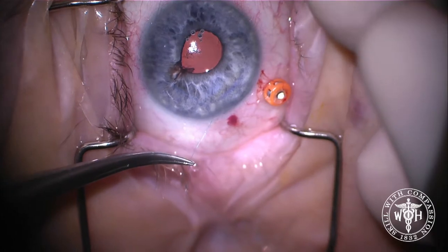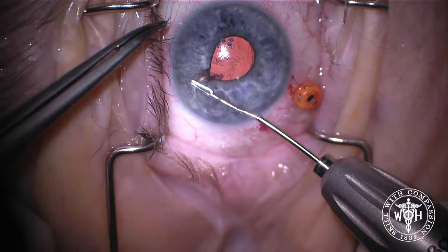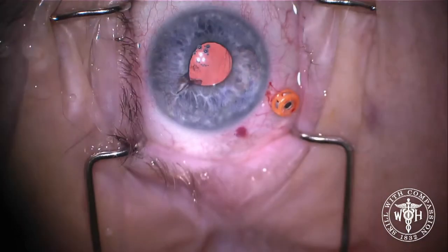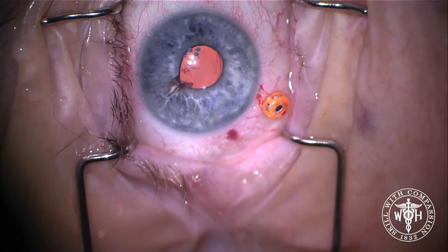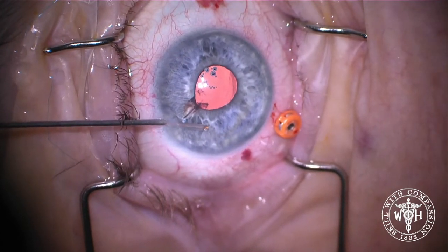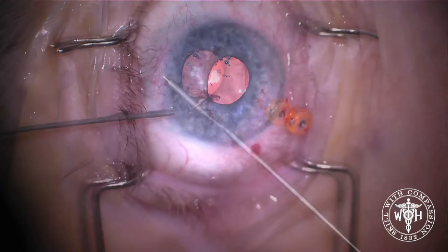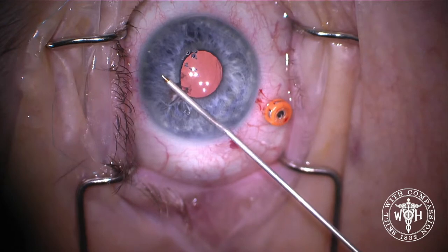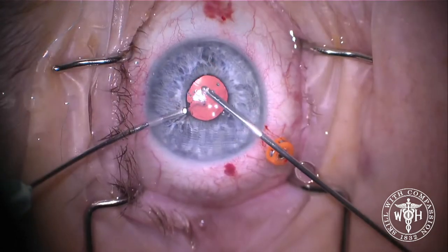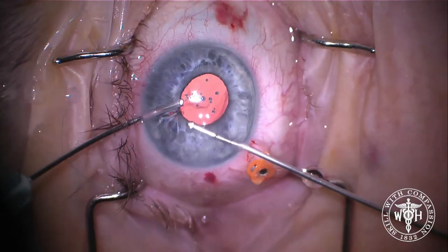What you'll often get in these cases is a little bit of a teardrop shape or a peak where you have brought the pupil border together, and there are a couple of different techniques you can use to get rid of that. In this case, we're using a thermal pupilloplasty. This is 25-gauge intraocular diathermy, set on a setting of around 10 to 15 — at least on the Centurion, which is the machine I'm using here. That cautery just causes a little bit of shrinkage of that iris stroma, and you can use it to reshape your pupil.